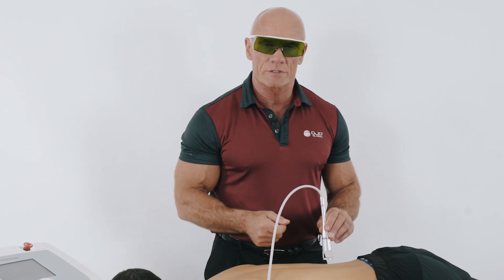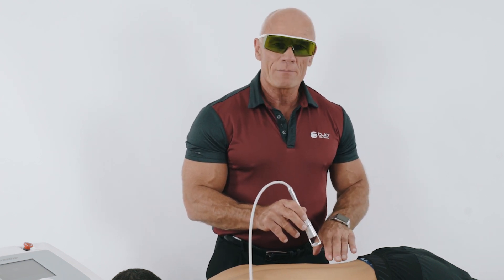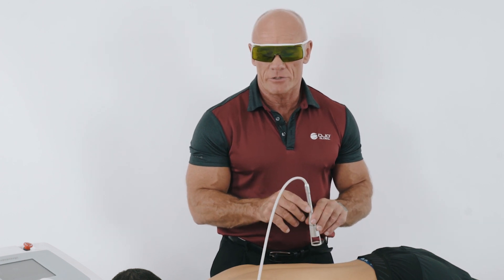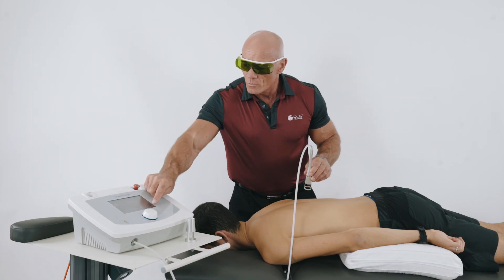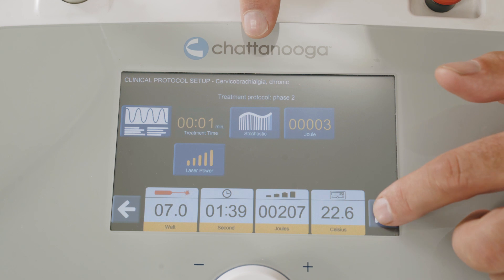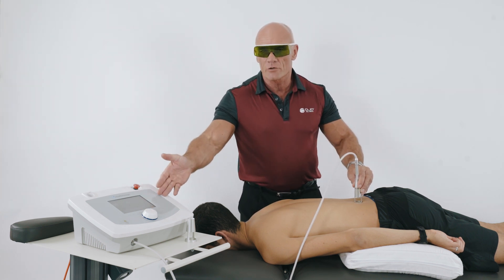We're now ready to move on to phase two. The parameters are identical to phase one. So because we haven't got a radiculopathy here, we don't need to treat the nerve root. But we may have a secondary satellite myofascial trigger point, or indeed we can skip phase two. I want to show you how to skip phase two. So once phase one has finished, we set the time for one second. I place my head, I press the foot switch after one second. Phase two is now completed and we've moved on to phase three.